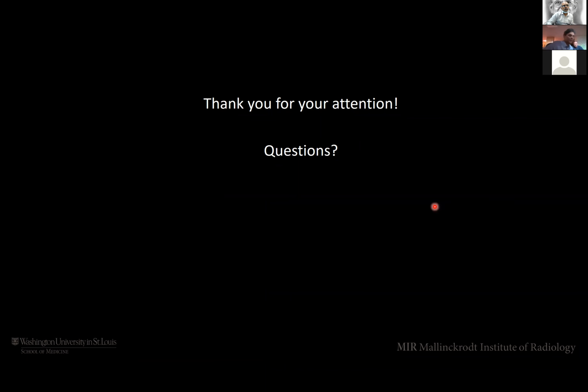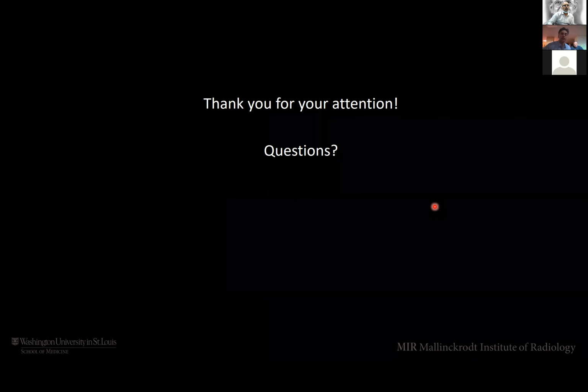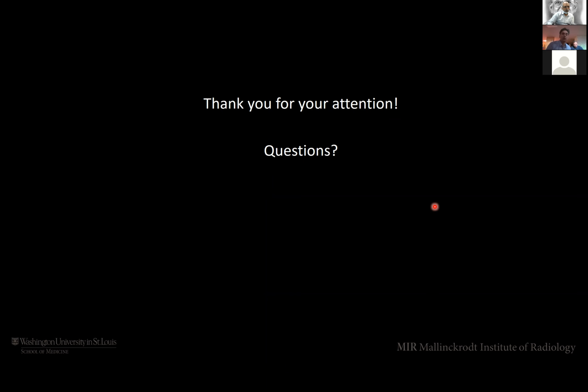See, if you have an R2 star derived sequence, my experience has been, even before R2 star became prevalent, we started using a multi-echo GRE sequence and quantifying it. So I am kind of biased towards it because it's a very easy technique. But if you have a robust enough R2 star and multi-echo, you could quantify it. That is a better way of doing it. If you do the R2 star values, that's always a better way.